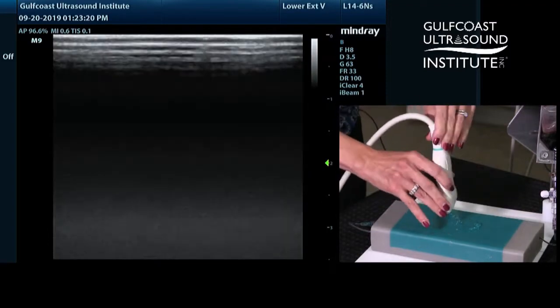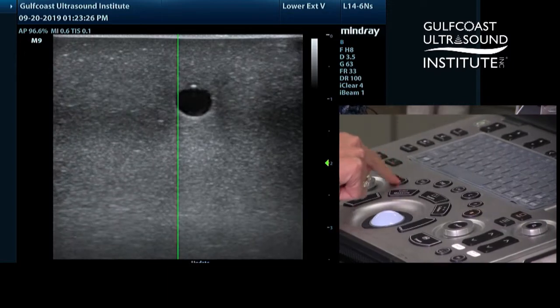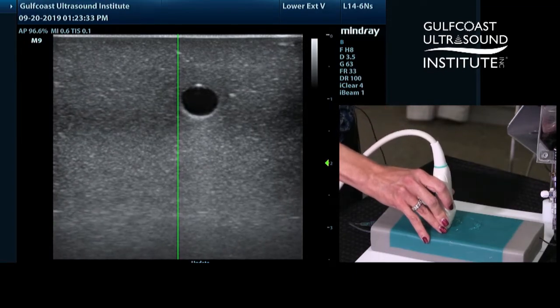So try this hot tip: use the M mode on your ultrasound machine. There should be an M button — you just tap M and that will default to the center of your ultrasound image. Then line up your target on that M mode line.